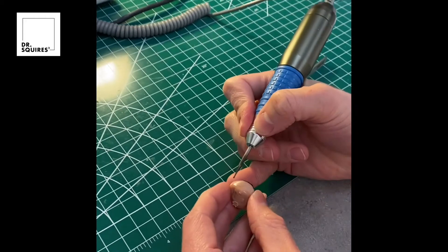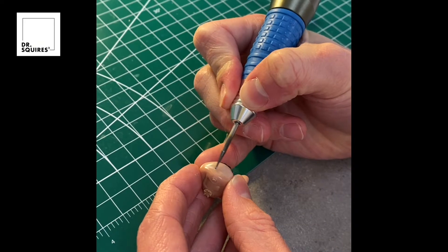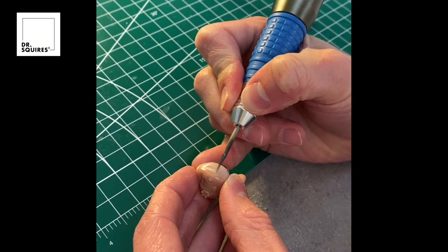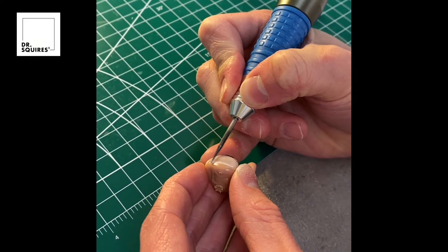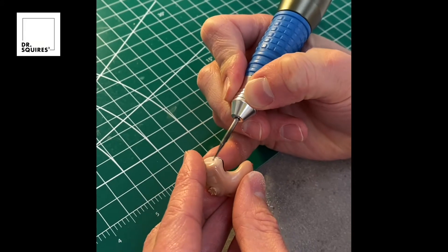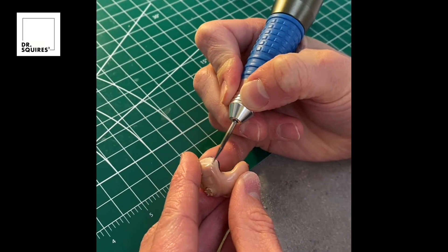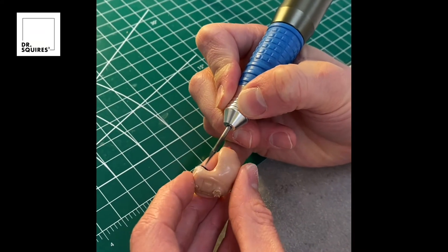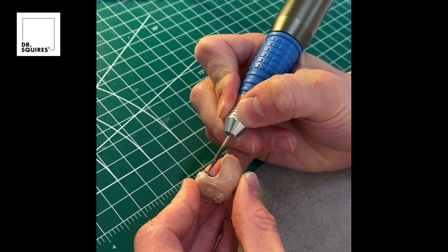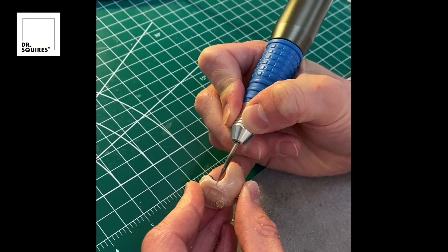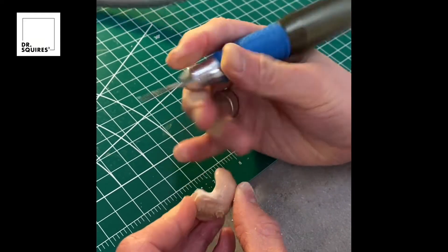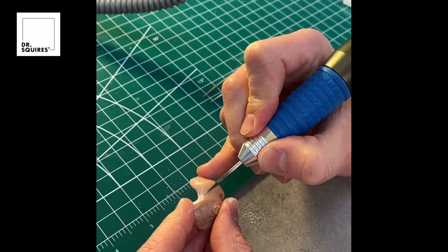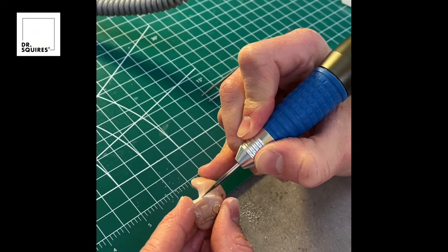What you're seeing here is I'm just running a burr bit along that crack, and we'll do this all the way around the hearing aid as far as the crack extends. We'll end up flooding this little crack or groove that we're creating here with an adhesive. We want to just give a good solid base for our adhesive to sit in so that it's more of a permanent repair and not just superficial.